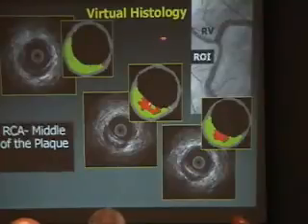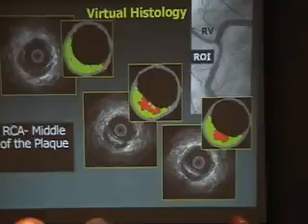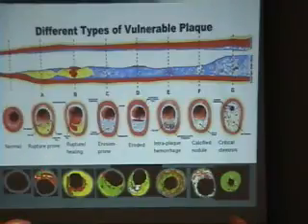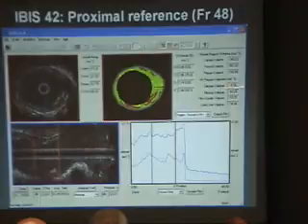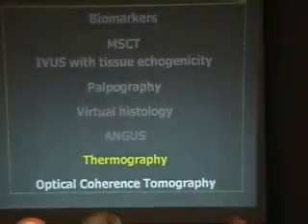And to come back to our patient again, it is amazing that in the middle of the lesion we saw this red lipidic necrotic core with a bit of calcium. And it is tempting, at least we have done that with Jim Willerson, to try to correlate more or less the library of virtual histology with the whole scheme of progression of coronary artery disease. And you can potentially quantify the calcium volume, the fibrous volume, the fibrolipidic volume, but at that stage we don't know if it will tell us something about the vulnerability of the patient.